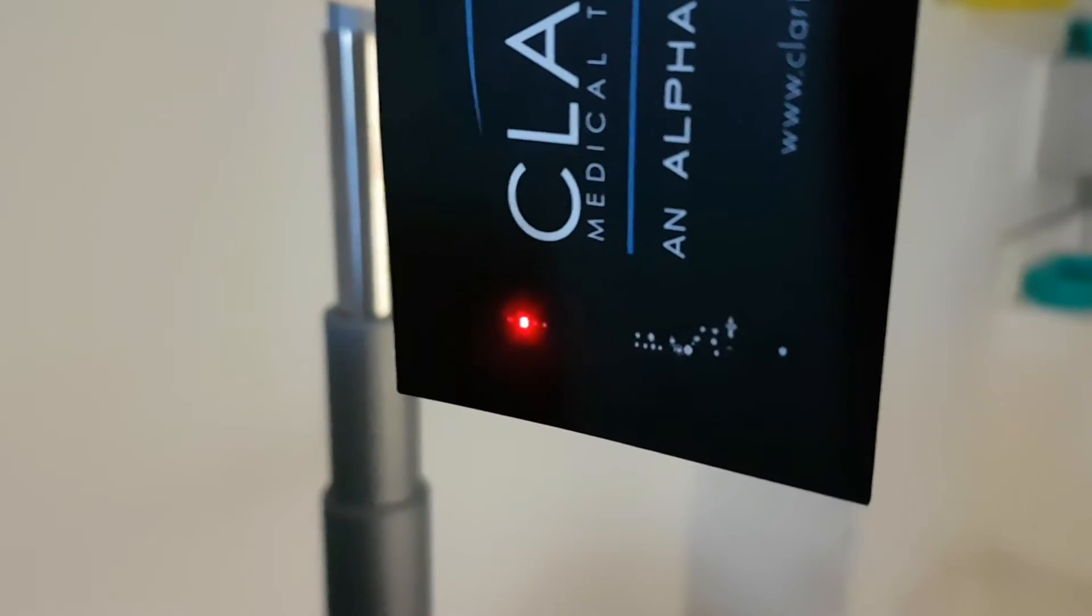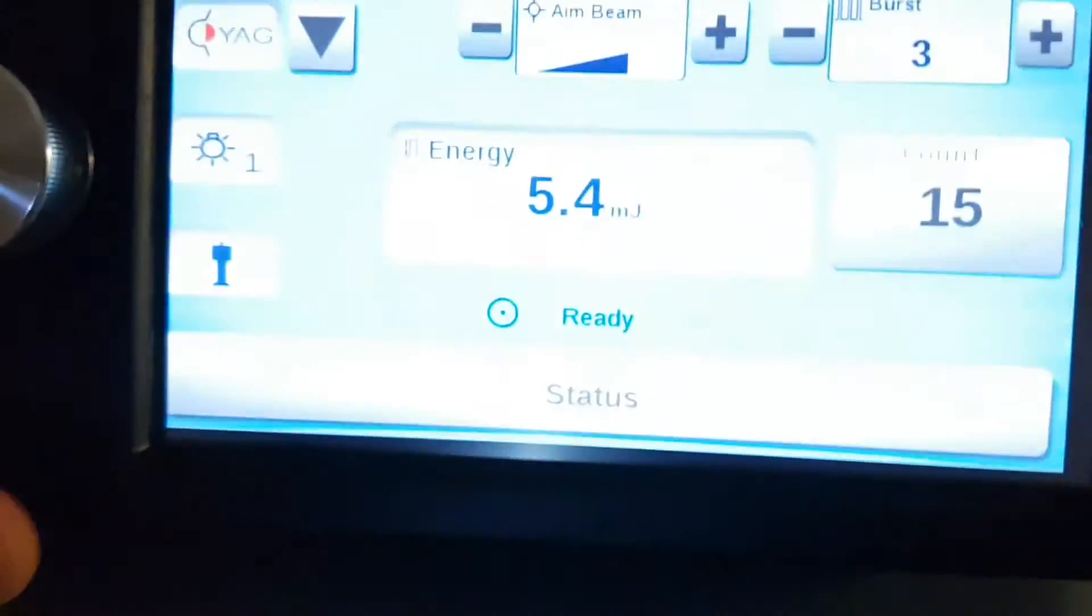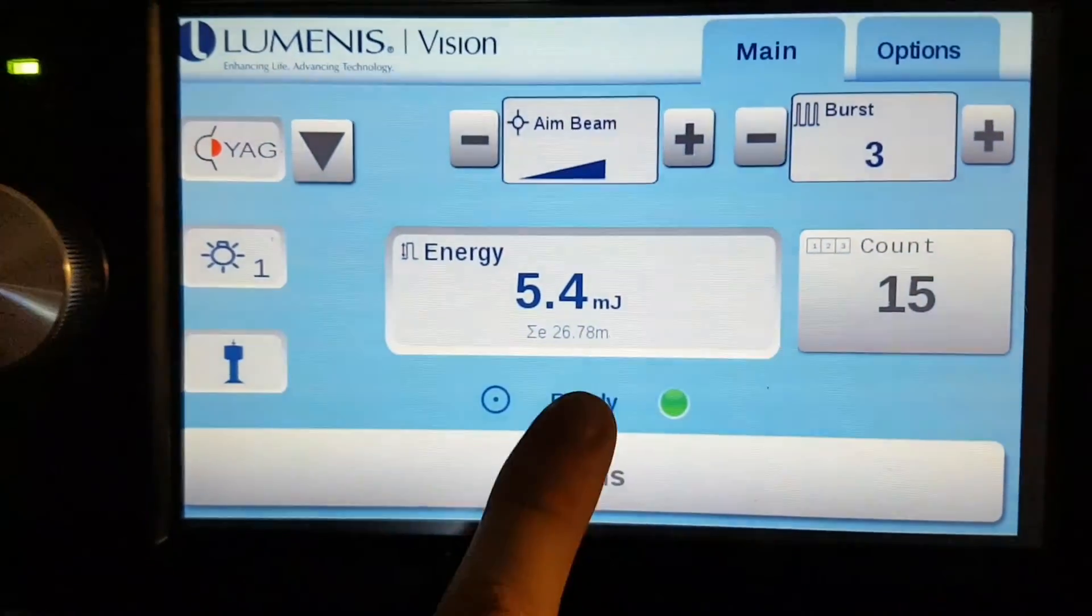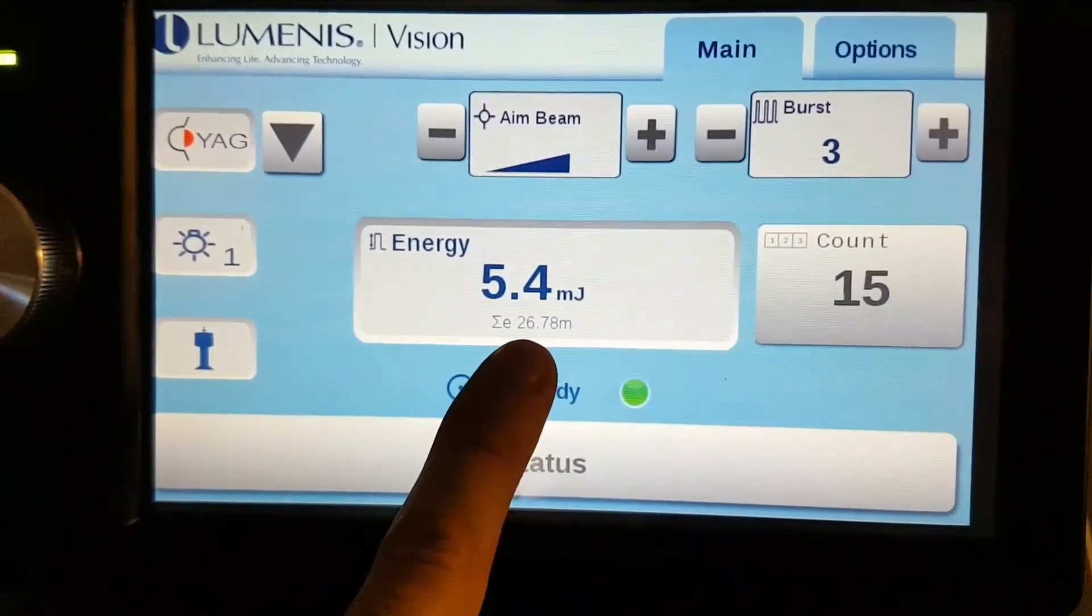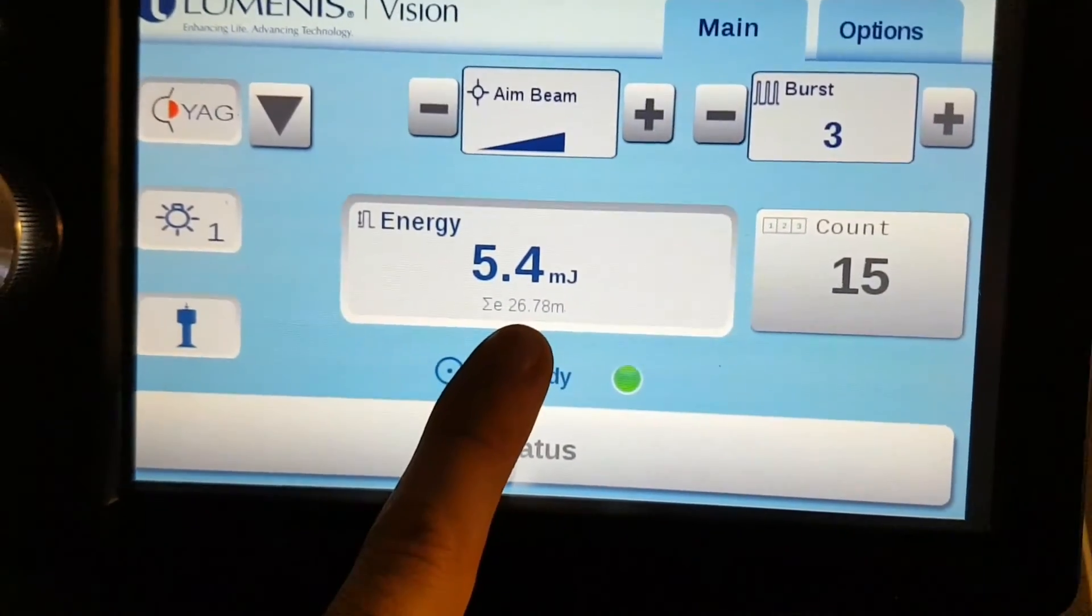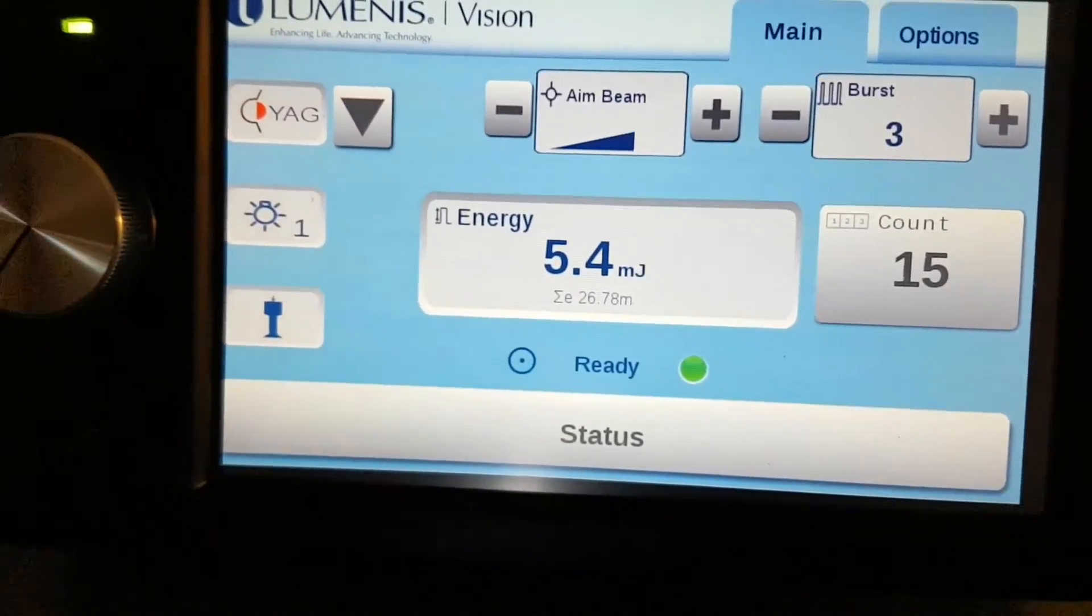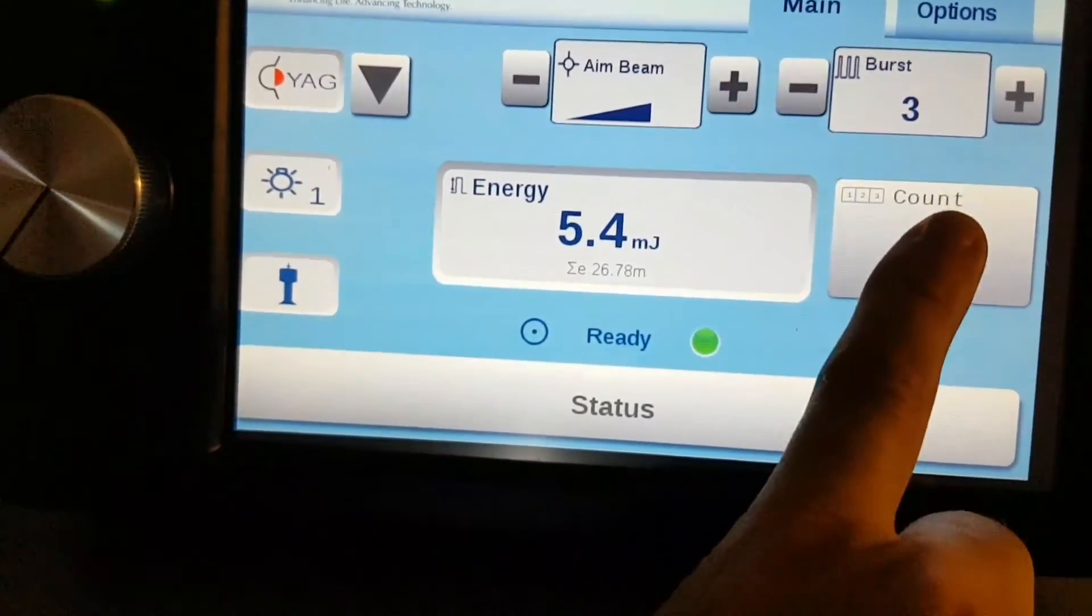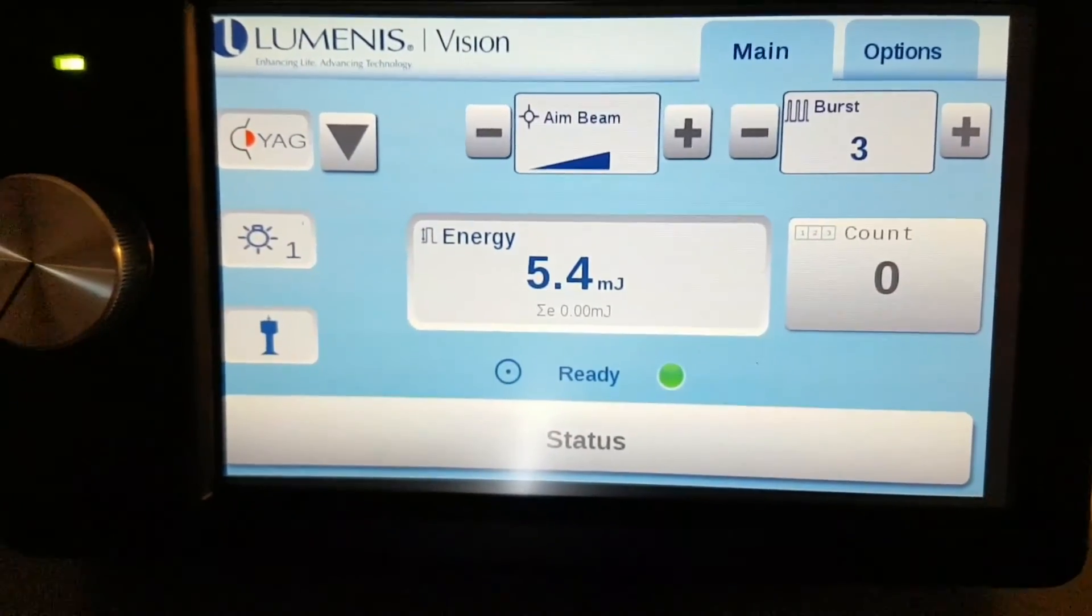Once you've done a few shots, you'll see on the screen here you'll have the sum of the energies you've shot into this patient. You have the shot count. In order to reset those, just press on count. Everything goes back to zero.